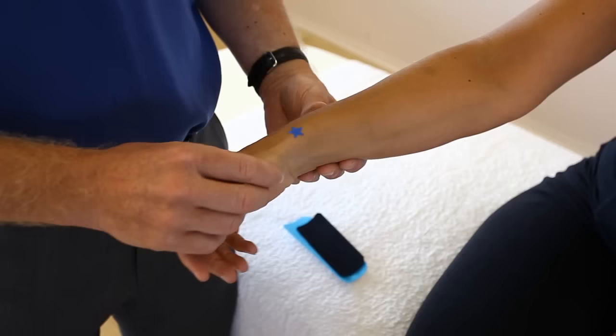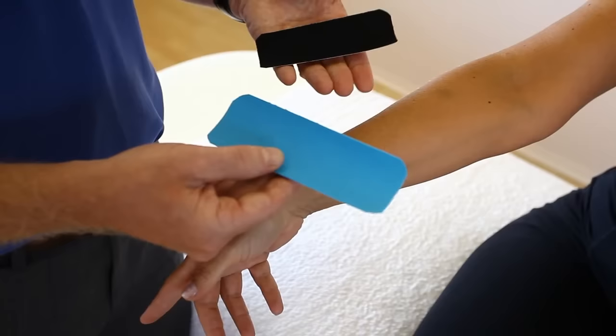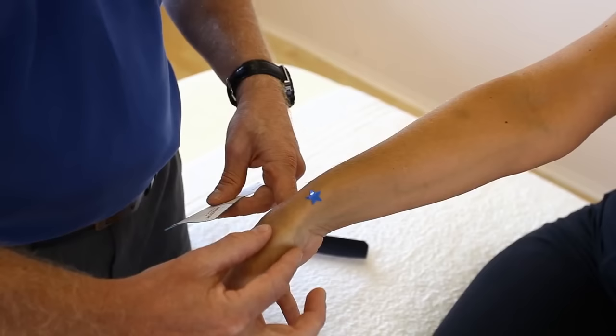What we're going to do is put the wrist onto a little bit of stretch — we're going to flex the wrist into what we call ulnar deviation. I've got two small eye strips, and the larger of the two is going to go from this aspect of the thumb, the distal part of the thumb, towards the forearm.